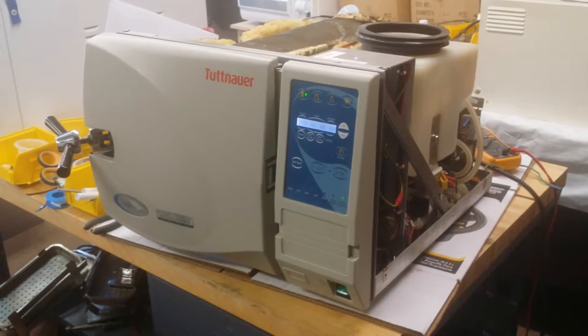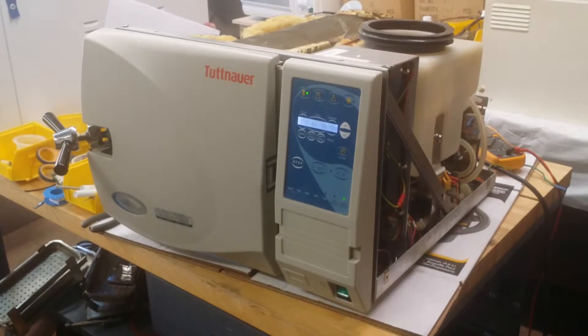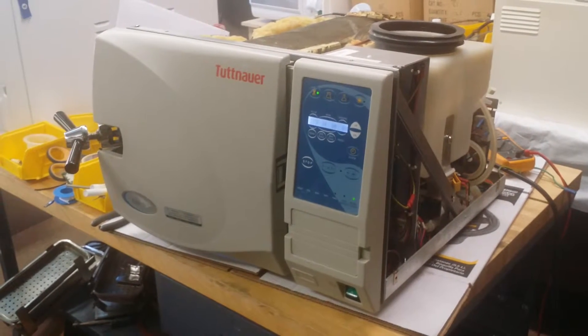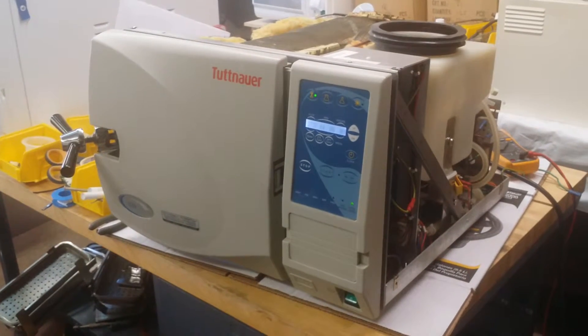This video shows you how to repair a Tuttnauer sterilizer. This sample machine is the Tuttnauer EZ series, EZ9. EZ9 and EZ10 are very similar — the difference is mostly the chamber size.